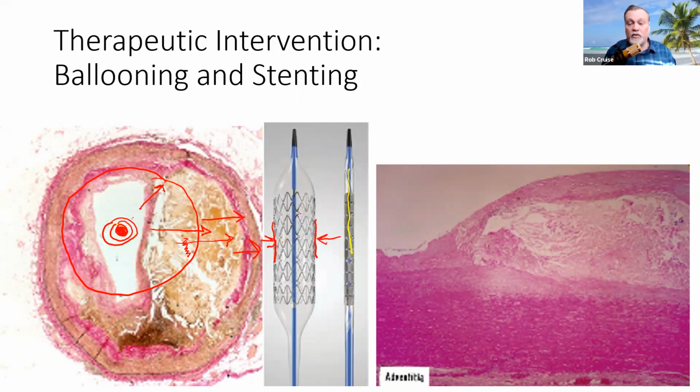Okay, so you hold that balloon up and inflated for an appropriate amount of time. Your physician will tell you when to deflate the balloon. It needs to be deployed for a certain amount of time to help whatever elastic fibers are left remember or reset to a new normal. So they say, we're no longer going to re-stenose or try to go back to the original value, because that will move the plaque back into your lumen.